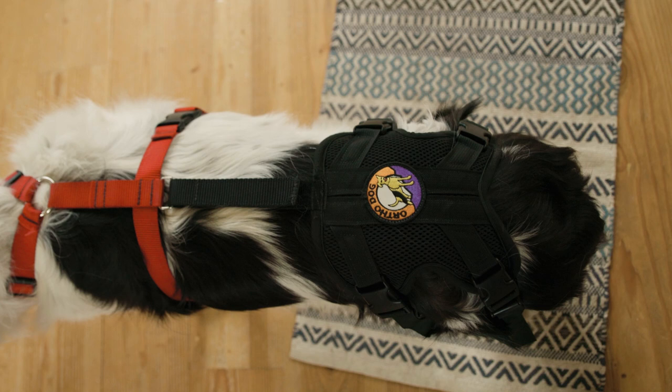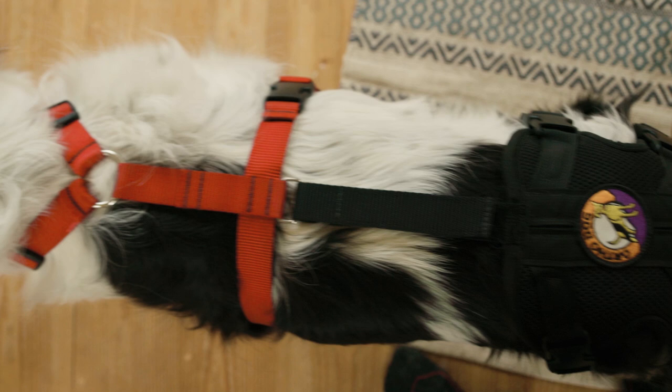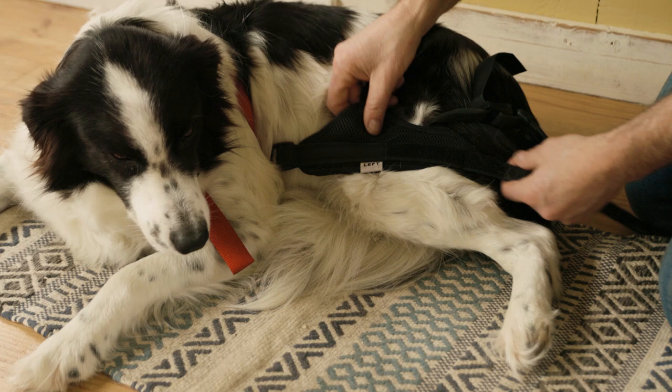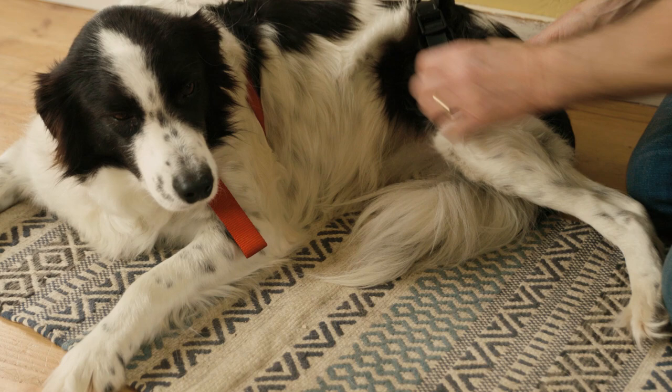Here we have the back support brace centered right over the top of Heather's spine, with the label running right down the middle of the spine, the strap attaching to that little metal clip around the harness, keeping everything square and aligned. This is the left uninjured knee brace — it's got the left marker which goes just above her knee on the outside of the leg. One velcro strap hooks underneath the leg and into a plastic clip, velcroing onto the top part of that brace. Then the two clips above are clipped in and anchored into the back support brace.